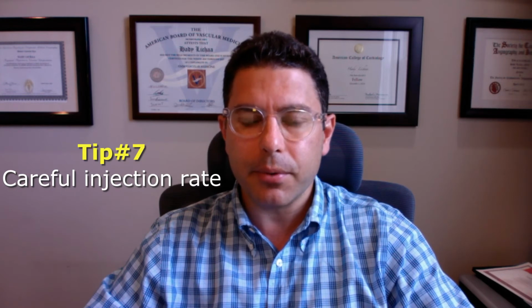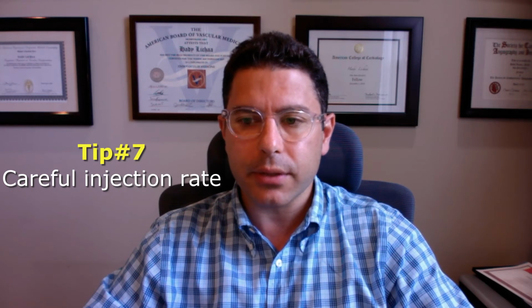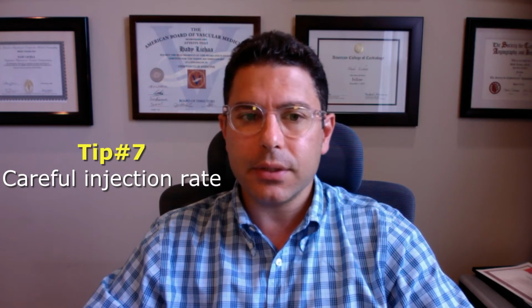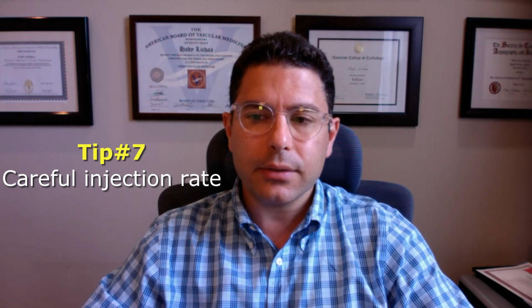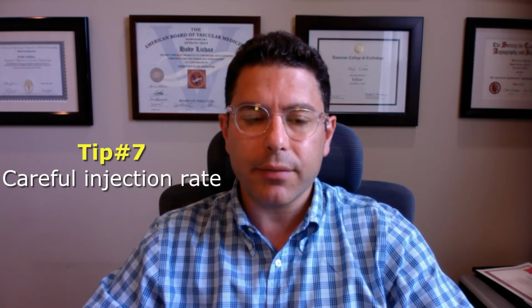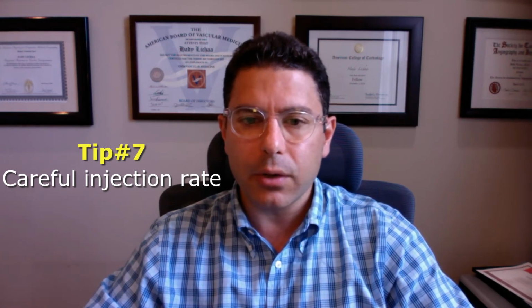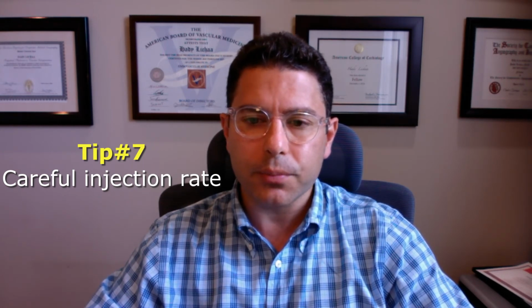In the aorta, and in the inferior vena cava, I personally inject 20 cc's per second. In the iliac arteries, usually 15 cc's per second. When you go down to the SFA and popliteal, 10 cc's per second. And in the tibials, usually 5 to 7 cc's per second. And of course, every patient is different. With your first injection, especially depending on the cardiac output of the patient, you'll be able to gauge the speed at which you're injecting CO2.